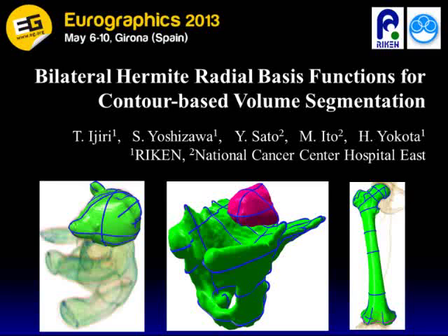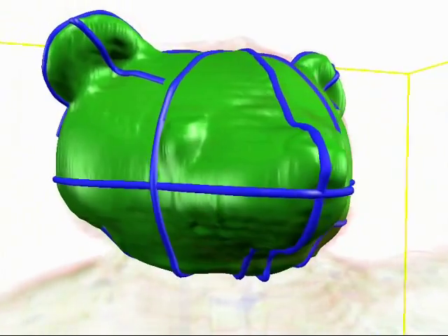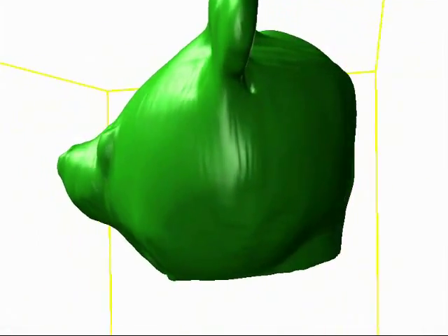We present a contour-based user interface for volume image segmentation. The user specifies multiple contours in the 3D space. Our technique generates a segmentation boundary which passes through the contours, fits to image edges, and has smooth shape around blurred areas.